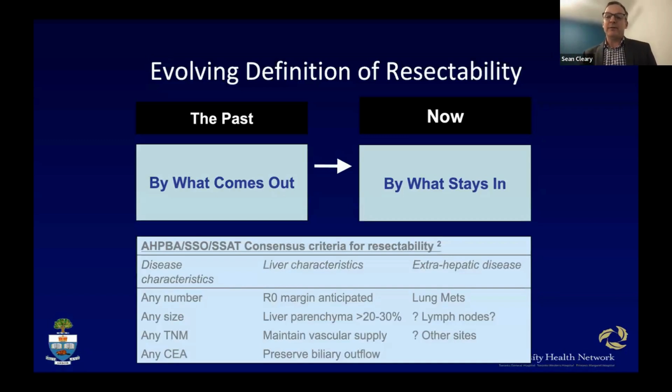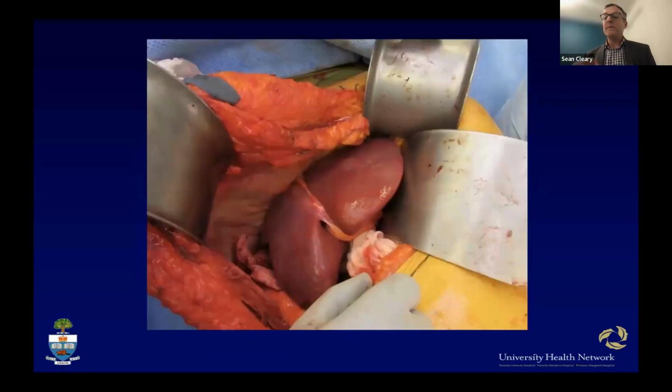And my least favorite phrase is innumerable metastases, because when we go through these with imaging, we need to know exactly where each lesion is, because each lesion is important. Because really, the only goal in surgery is to achieve an R0 resection, which is complete resection, maybe with ablation of all lesions.